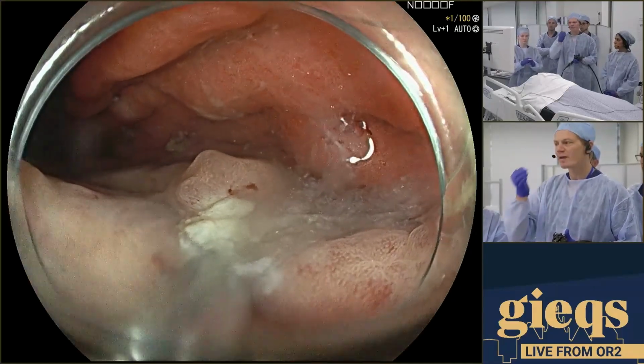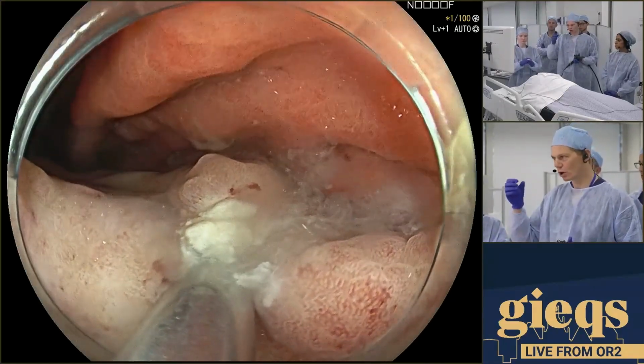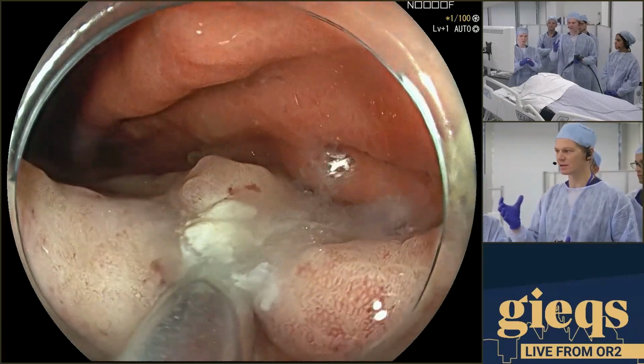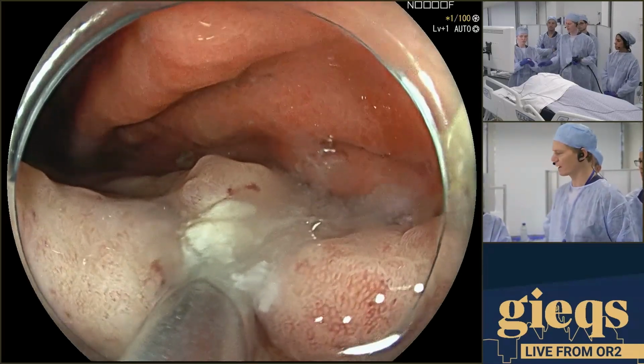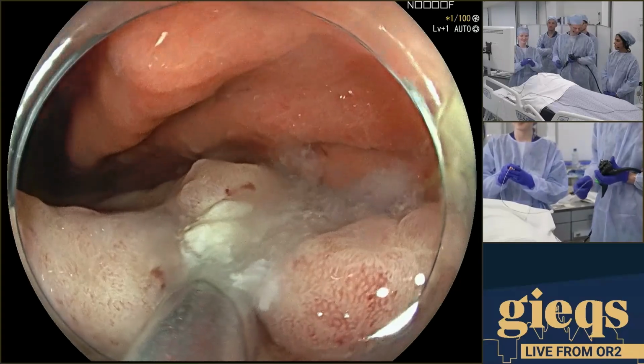So whenever you clip anything, you have to ask your nurse to close it gently and slowly. You never, even in a situation of bleeding, you never shoot it really rapidly. So you have to be calm, you have to communicate well, look into eyes, and close it.